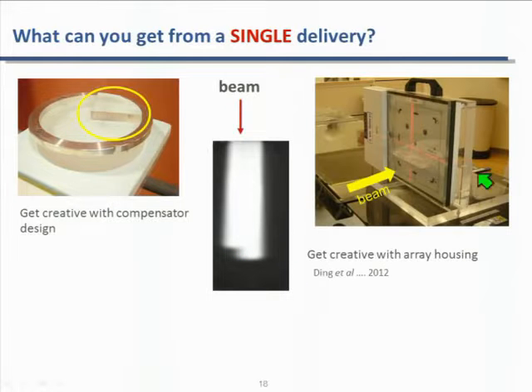So you can use this concept, take one of those commercially available devices like this one, and put it in an in-house phantom. This device is normally used in photon clinics for morning warm-up. They already have different build-ups in front of the detectors. You can add different build-ups in front of them. It doesn't matter where you put the build-up, as long as you have several detectors and a single beam delivery, you can play with that build-up to give you all the data points you want to characterize your beam.